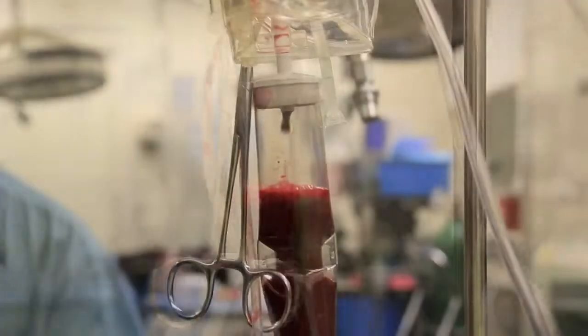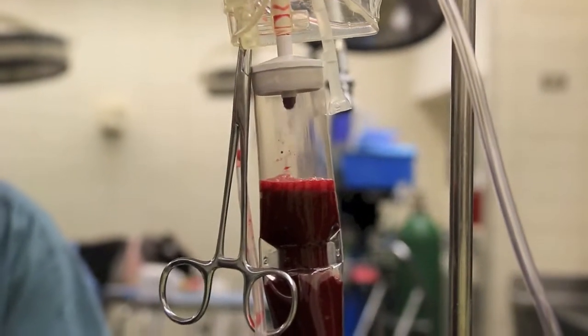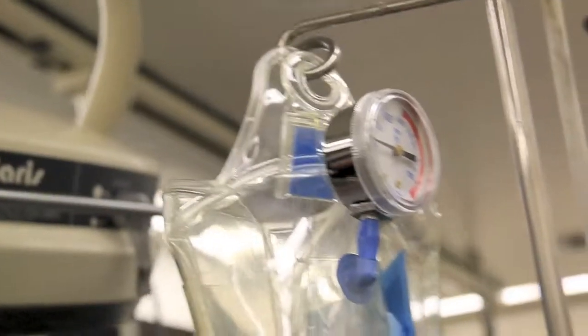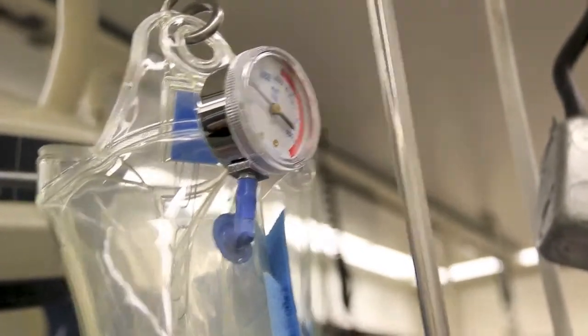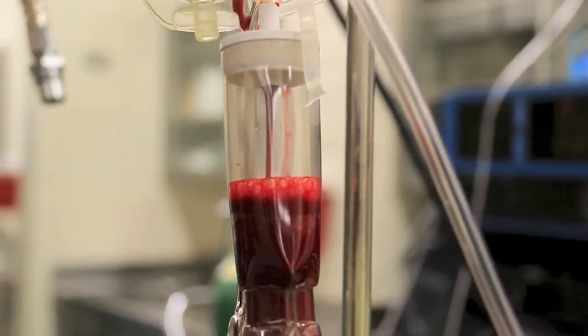Pump it up to 100. Look at the flow rate at 100. Okay, go up to 200. Wide open at 200. Here it is at 200 — now let's go up to 300.